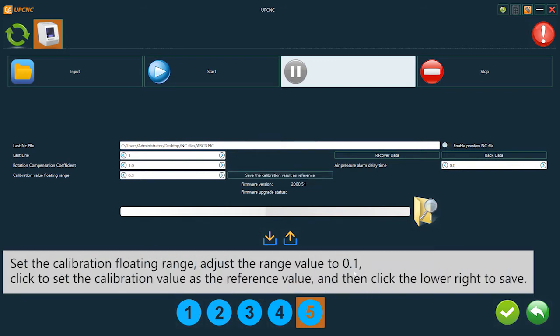Set the calibration floating range. Adjust the range value to 0.1. Click to set the calibration value as the reference value, and then click the lower right button to save.